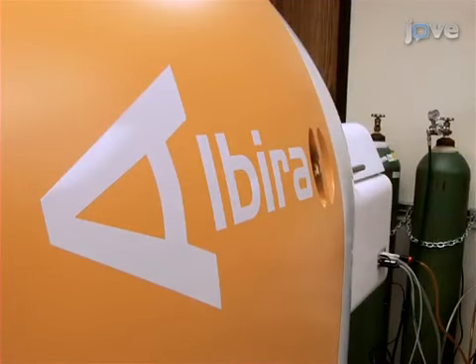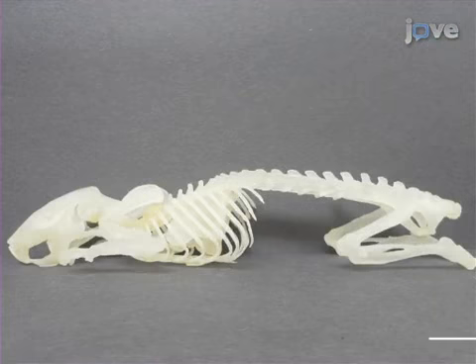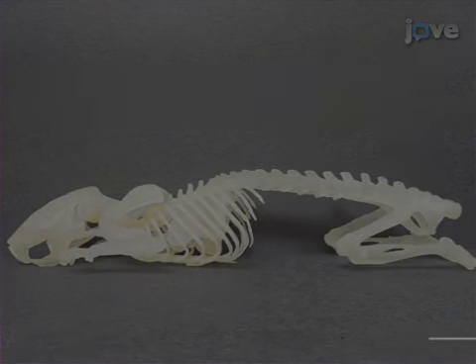All in vivo and ex vivo imaging performed for this protocol demonstration was acquired using the Albira X-ray computed tomography system. Images were reconstructed using the filtered back projection algorithm via Albira Suite 5.0 reconstructor.